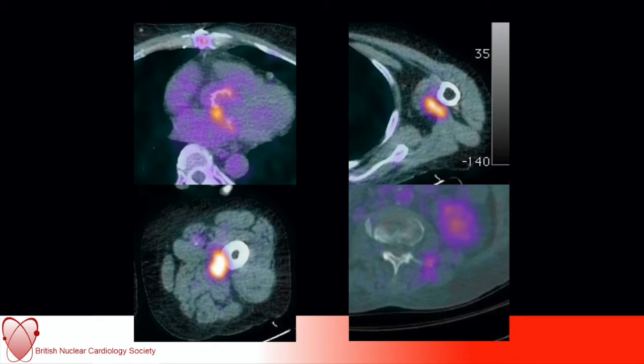So these are the highlight slides, if you will, showing focal increased uptake on the aortic prosthetic valve and muscle uptake in his left thigh and in his left arm, as well as osteomyelitis with destruction of a transverse process of the lumbar vertebra. So in one test we confirm the diagnosis of endocarditis and can effectively stage the disease, demonstrating where infection has seeded.